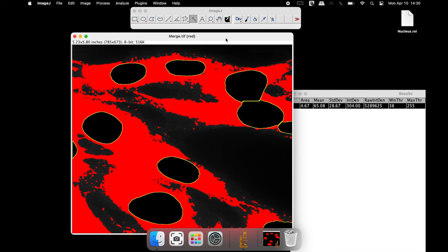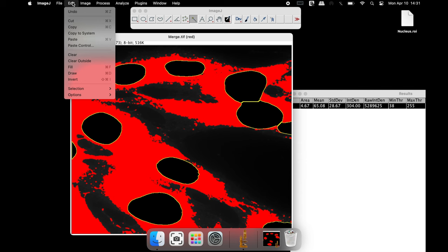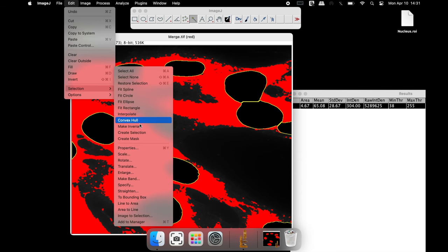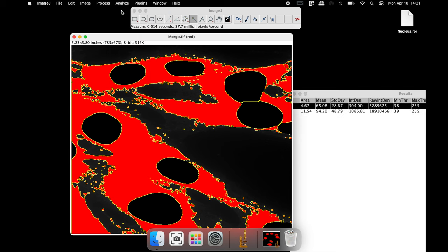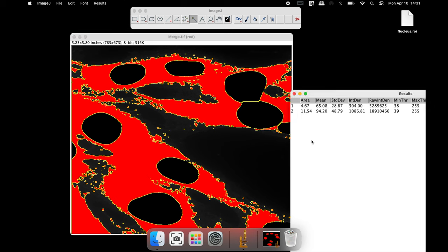For measuring the cytoplasmic staining intensity, select the image and click on Edit, Selection and Create Selection. Now all the cytoplasmic areas are selected, excluding the nuclei areas. Click on Analyze and Measure — the area and other results are displayed for the cytoplasmic staining.